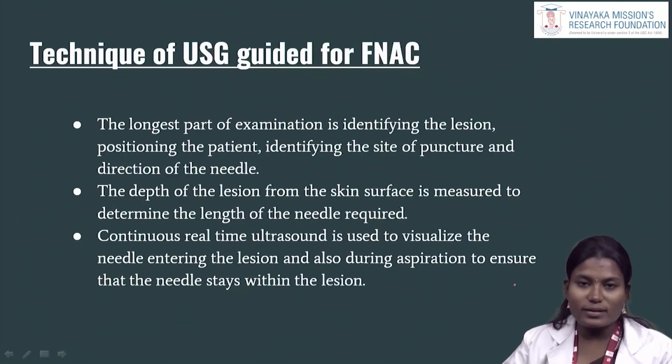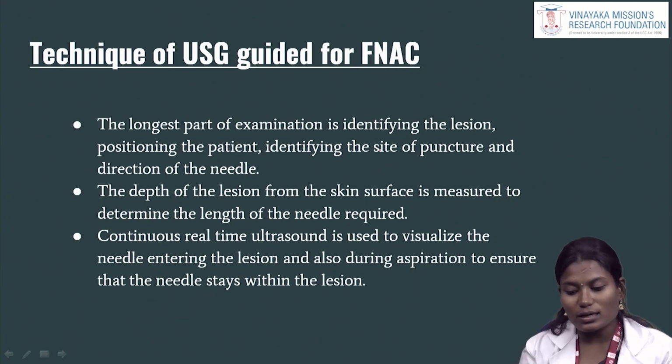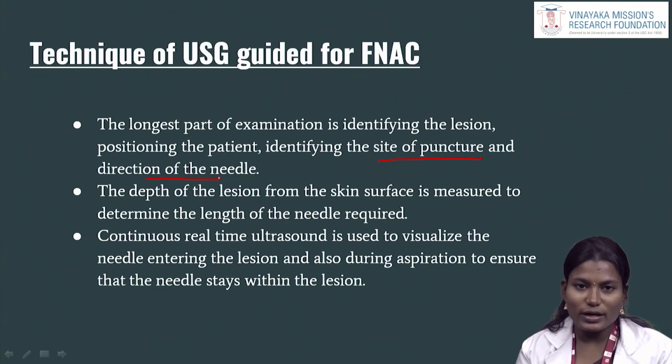This is a simple protocol for deep-seated lesions. The longest part of the examination is identifying the lesion and the position of the patient, identifying the site of the puncture and the direction of the needle. We first have to find the lesion area and the puncture site on the patient. The depth of the lesion from the skin surface is measured to determine the length of the needle required. Continuous real-time ultrasound is used to visualize the needle entering the lesion.